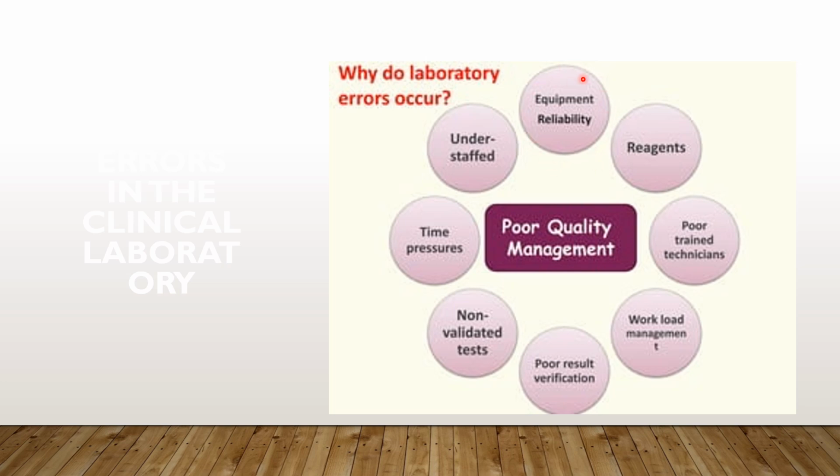It means equipment is not properly calibrated, interday or intraday, so it may lead to error. Then reagents should be of quality, should not be expired, and should be properly kept as per the protocol instructions. If not, that can be another reason leading to error.